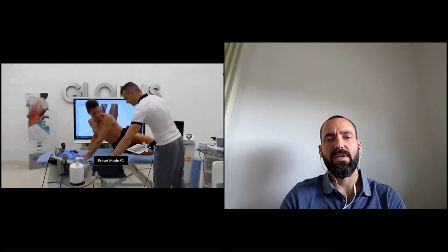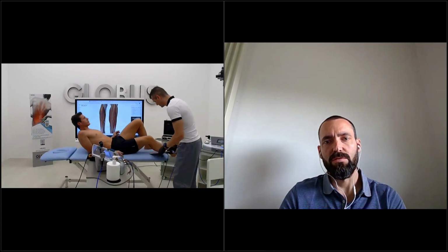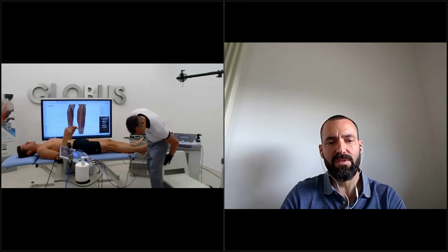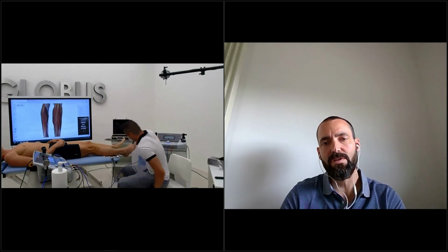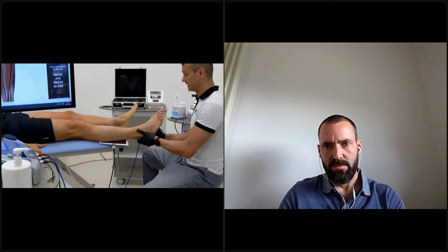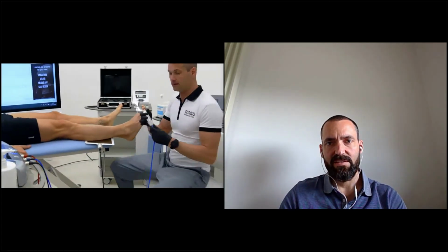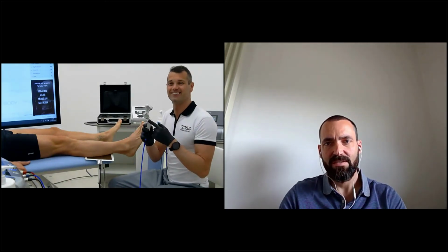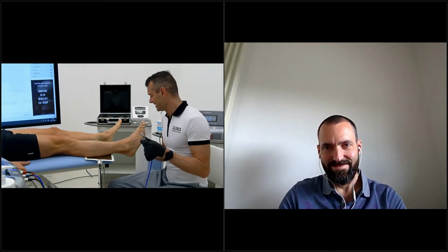Yeah, usually I do like that, to shorten the geometry, and I can put more pressure when I use the trigger for plantar fasciitis treatment. Yeah, that's right, exactly. This is the position. Usually I use the trigger.